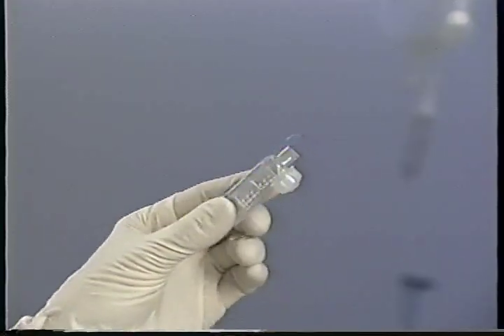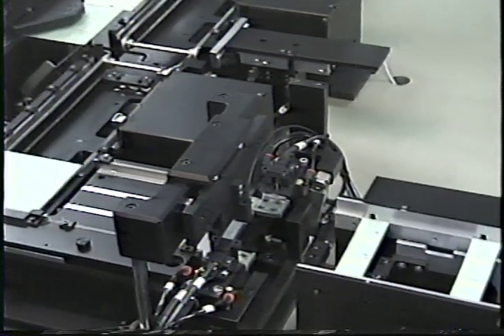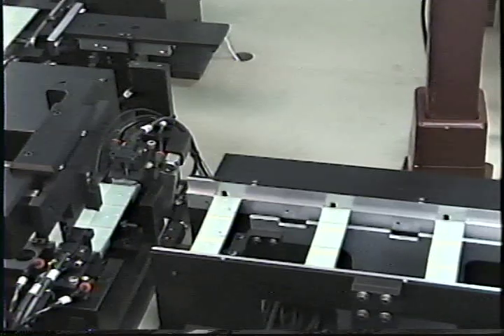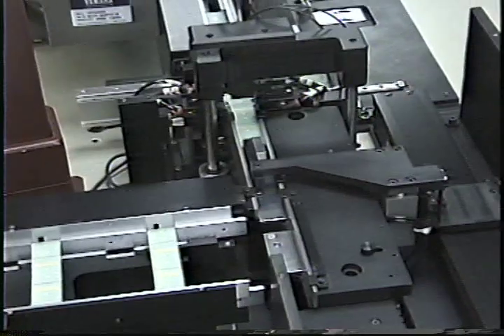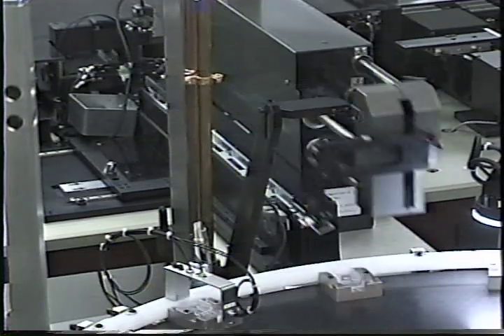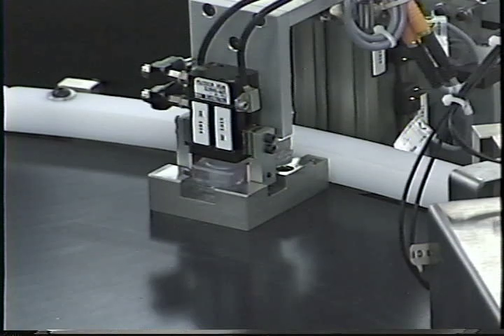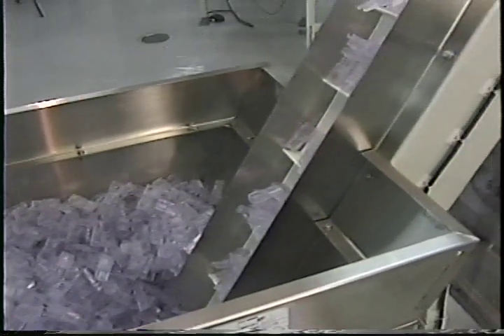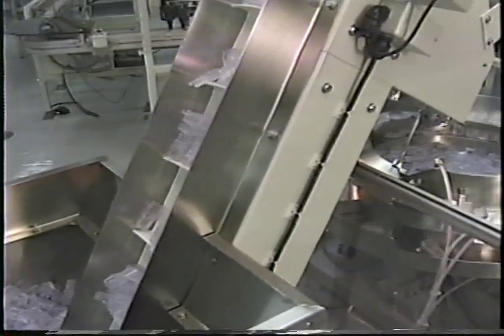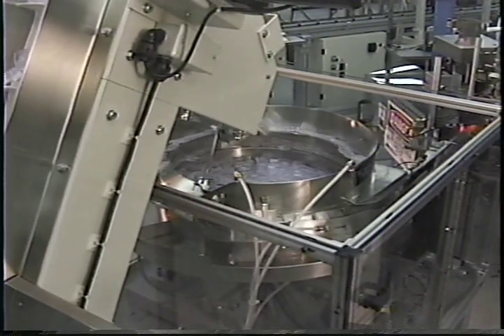The IRMA cartridge is a snap-fit design. In the assembly and packaging area, finished panels are automatically broken into individual chips. The chips are placed in the flow cell base and assembled using a turntable line. The cartridge bases and the flow cell windows with molded gaskets are placed into hoppers and fed into bowl feeders that feed the parts onto a conveyor belt leading to the turntable line.